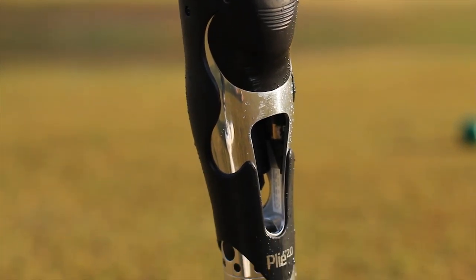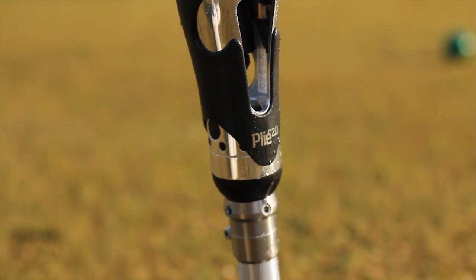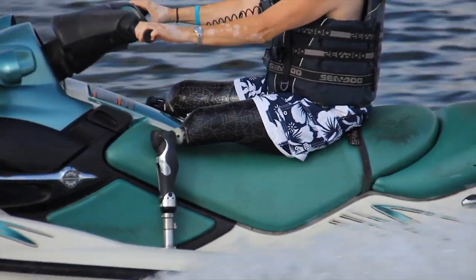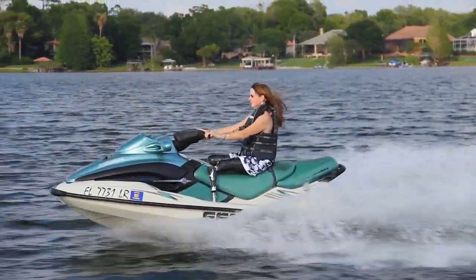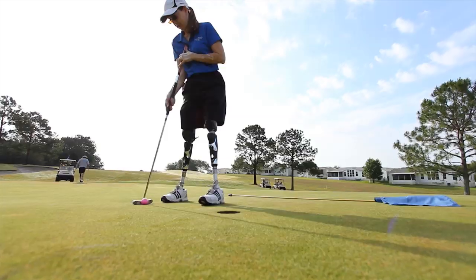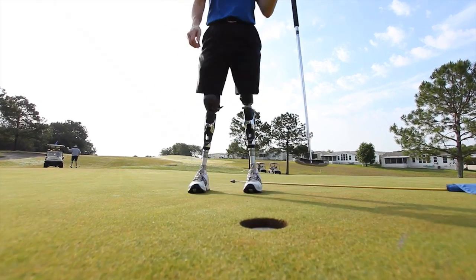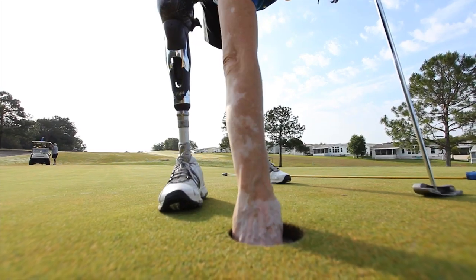The other thing that I really love about the Plie is the water-resistancy — and it's actually waterproof as far as I'm concerned, because I've played in the sprinklers, I've gone on jet skis, and they work fine. The other good thing about it is it's super lightweight. For me as a bilateral, having a knee that's lightweight is super important.